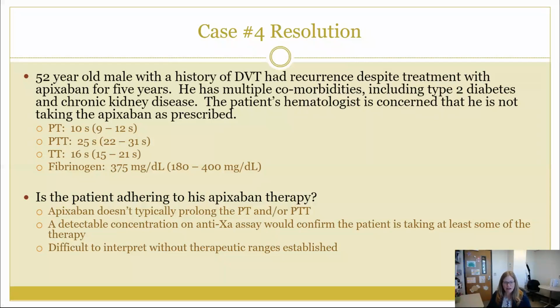You could advise getting an apixaban calibrated anti-10A assay. If there was a detectable concentration on that assay, then you know that the patient is at least taking some of the therapy, but we wouldn't know if he's taking it twice a day as he should be, because we don't have an expected or therapeutic range for that. So again, it is difficult to interpret until a therapeutic range is established.